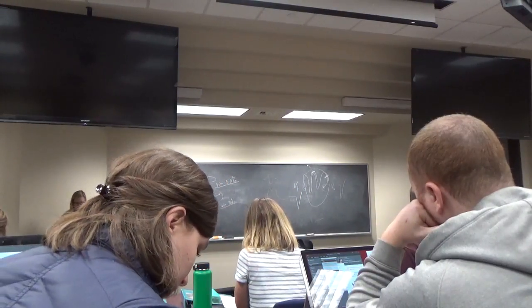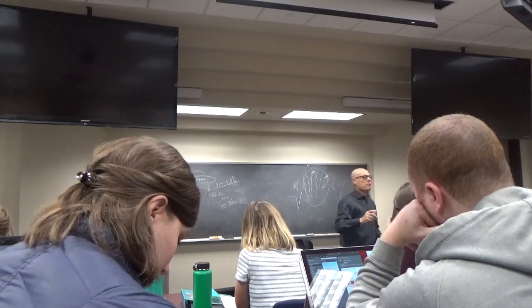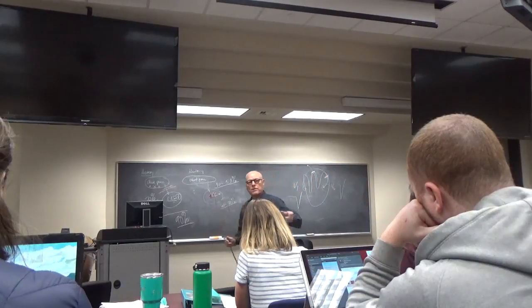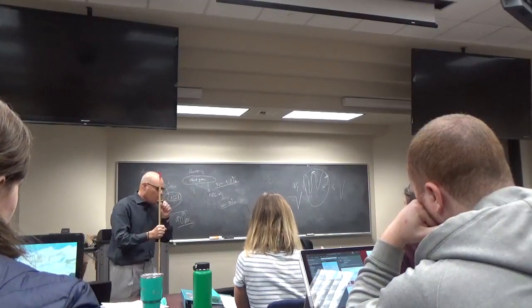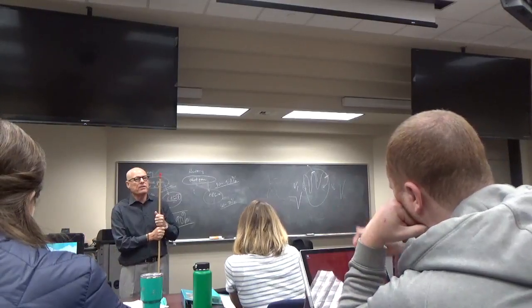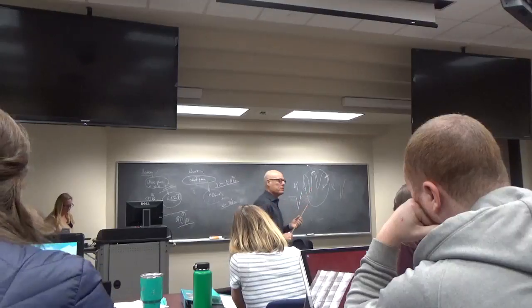Oh, well, look over here. On the circumflex, there's a 40% lesion, says the radiologist. Oh, yeah, I didn't see that. Run that back again. So they run the film again, and almost never did those percentages get changed standing there talking. 70% lesion LAD, 40% lesion.